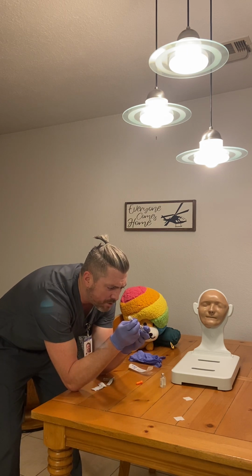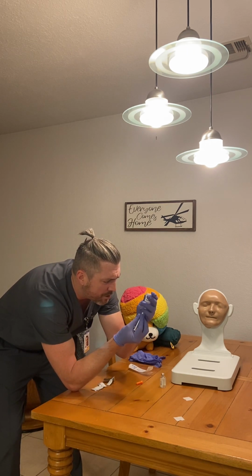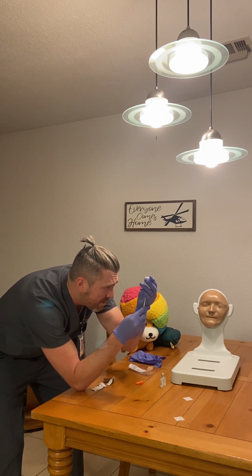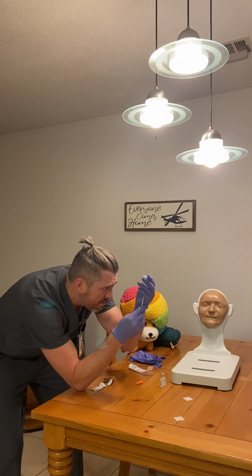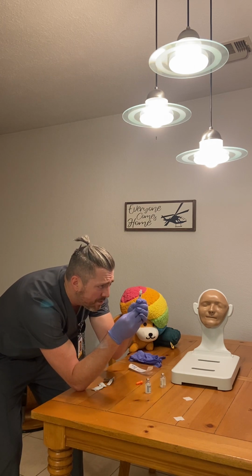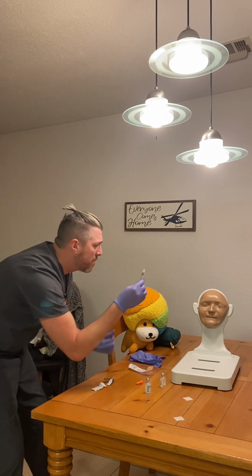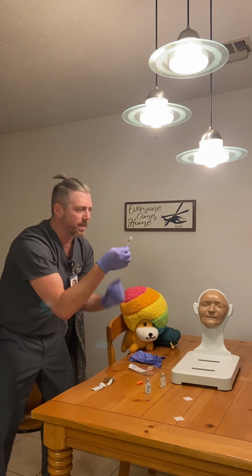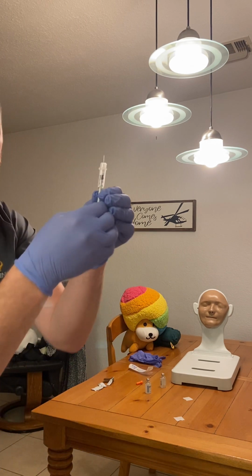I'm going to add the 8 units for a total of 12 units in this. And my nurse agrees. I'm going to draw up. There's no air in this one. So there we go. Confirm 12. The 8 added for 12.